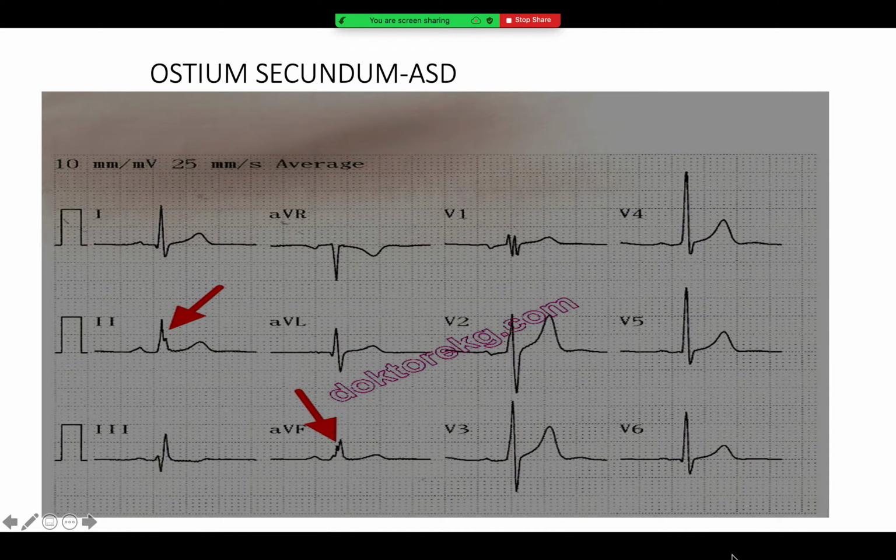So for example, how do we start reading the ECG? What are the different steps? We start with, for example, rate. Okay, this is not a 12-lead rhythm strip or something. So rate, rhythm, then abnormalities like the P wave, the QRS, the different segments, and then on an overall basis you can go for the final impression. So let's start with the P waves. What do you think? How are the P waves?